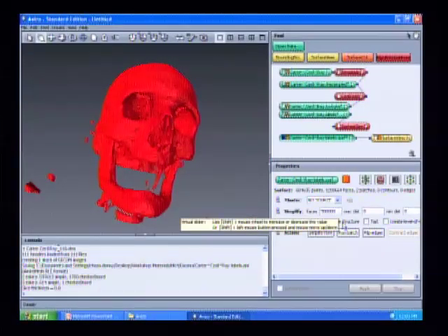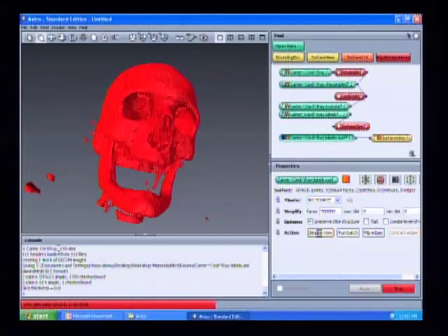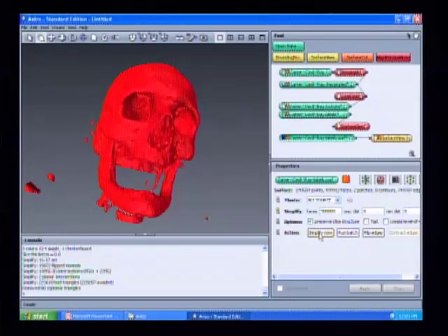Once you enter that number into faces, you want to select the Preserve Slice Structure option directly under Simplify Faces. And then you want to go ahead and hit Simplify Now. Your loading bar at the bottom should go through, and what it's doing is simplifying all the way down to that number. Now that's updated, and you'll see that it's reduced it to close to 500,000 faces.